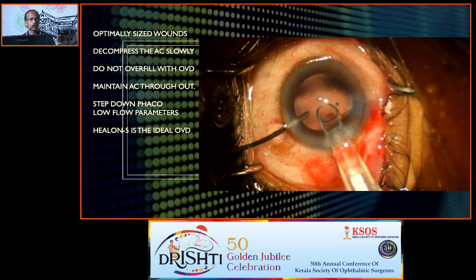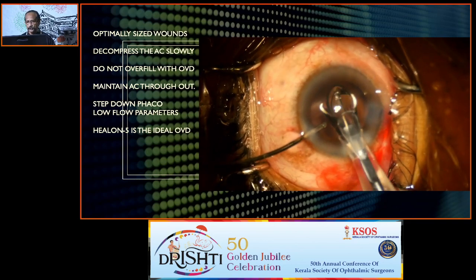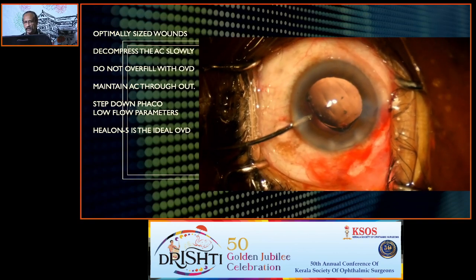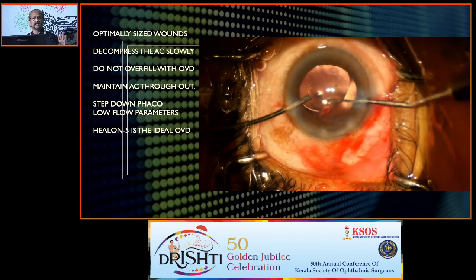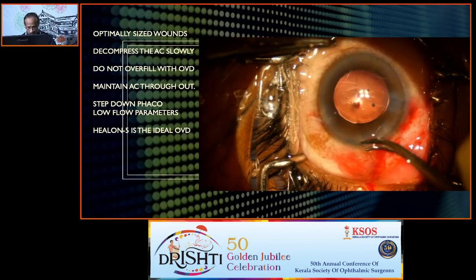Please remember not to overshoot and hit the angle, hit the bag and create issues. So very gently, very soft pushes so that it goes into the eye nicely. And always remember, hypotony in the postoperative period is a complication which you want to avoid. Always suture the wound before you leave the table.